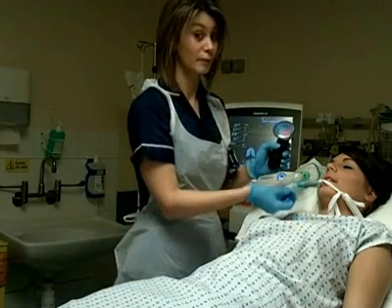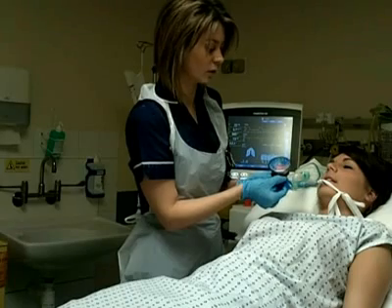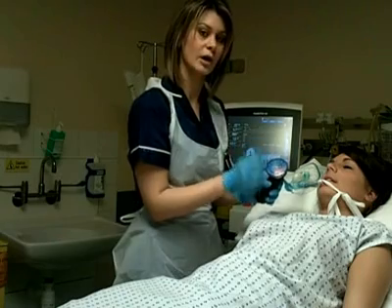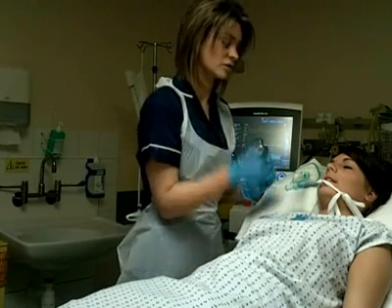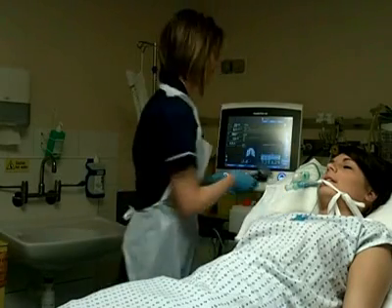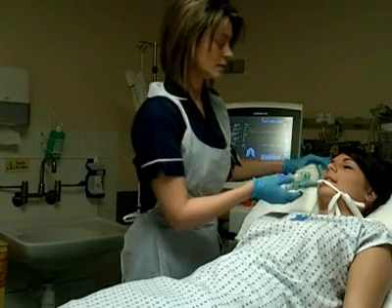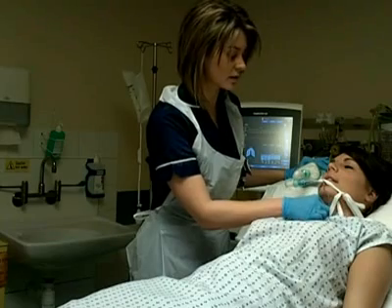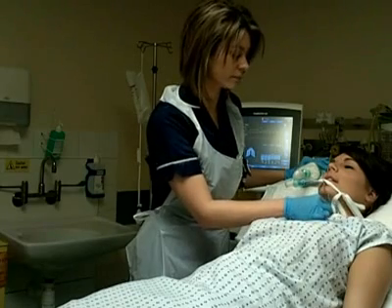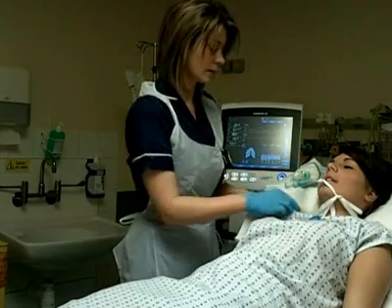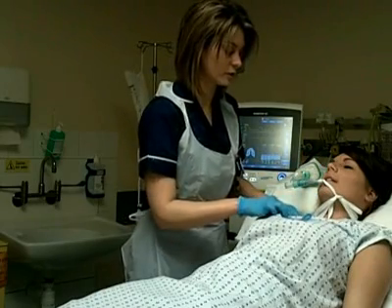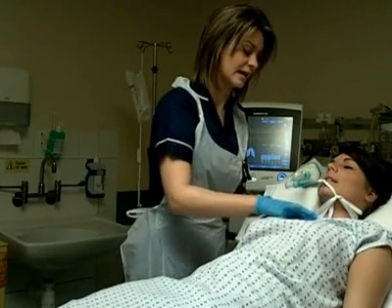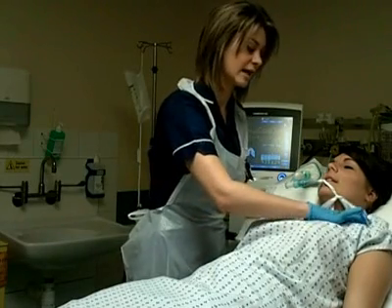Using the cuff pressure gauge, when you place it on, you want to make sure it's in the green section. You don't want the cuff too low as secretions can track down into the lungs. Once we're happy the airway is in place, we check for any signs of tracheal deviation — there isn't any — and then feel for surgical emphysema, which could indicate air within the tissues. I can't feel anything there.